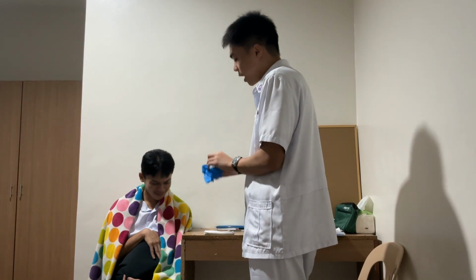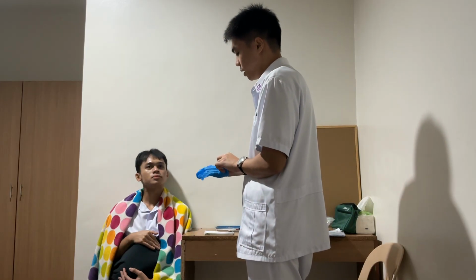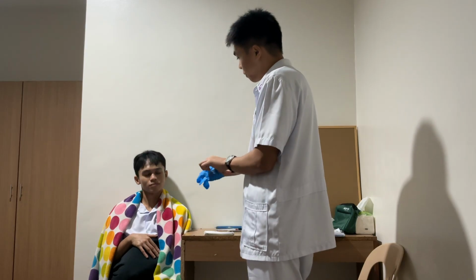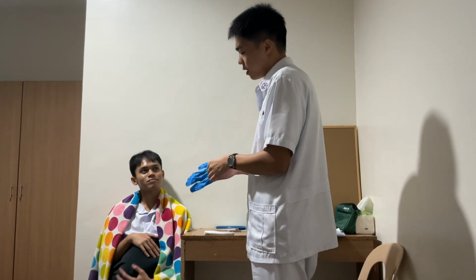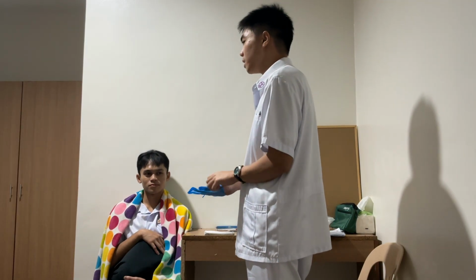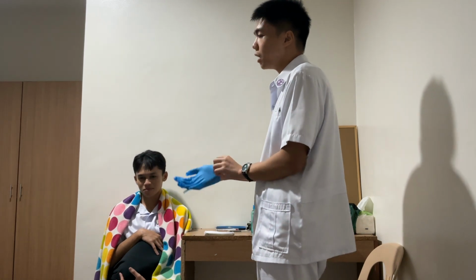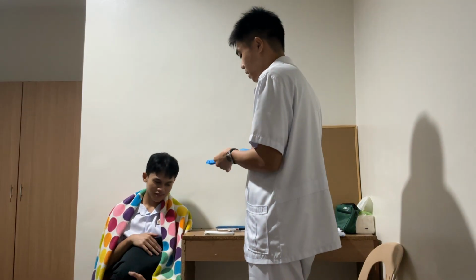What I'll be checking for you this morning is the temperature. With the temperature, we get to see if you're too cold, too hot, or normal. After that, we will be taking your pulse rate, the heart rate. From the word pulse, how many beats your heart does in a minute.